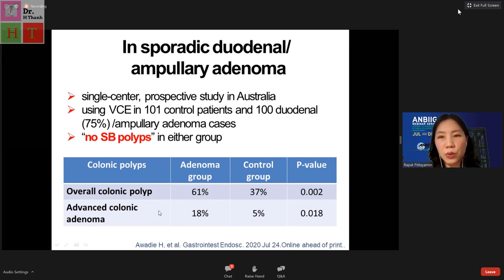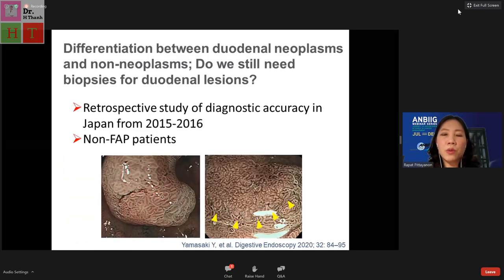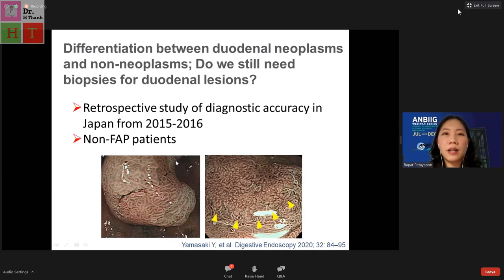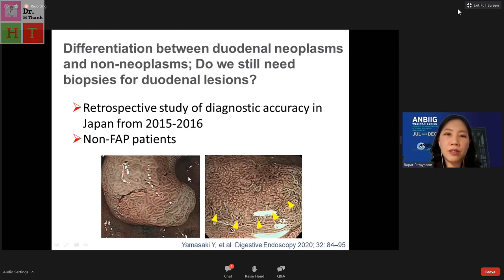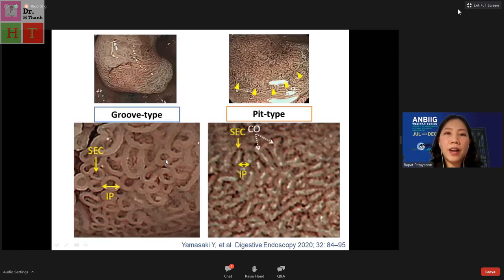Interestingly, patients with sporadic duodenal adenoma had higher overall colonic polyps and advanced colonic adenoma compared to controls. A Japanese study in non-FAP patients found two types of epithelium: groove-type epithelium and pit-type epithelium. Using magnified endoscopy, the groove type shows sub-epithelial capillaries and brownish vessels with an intervening part, while pit type shows a crypt opening visible as a white line.